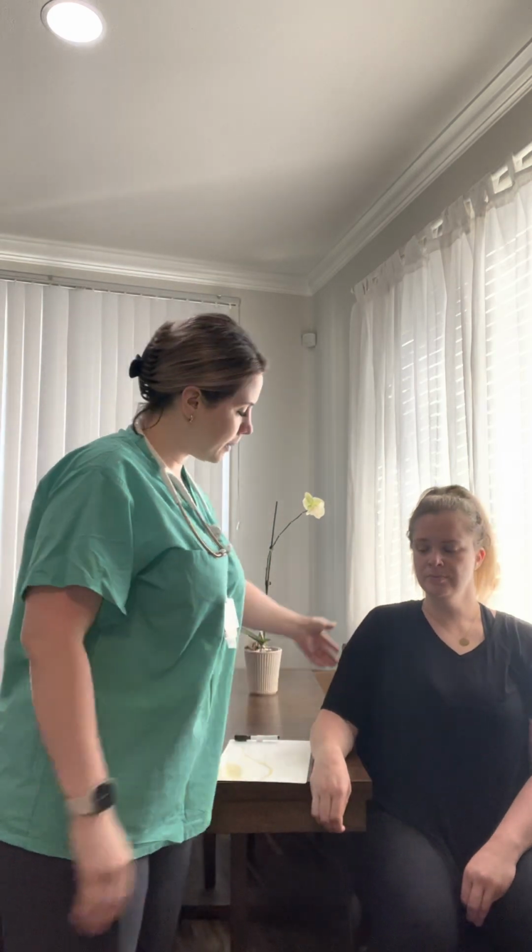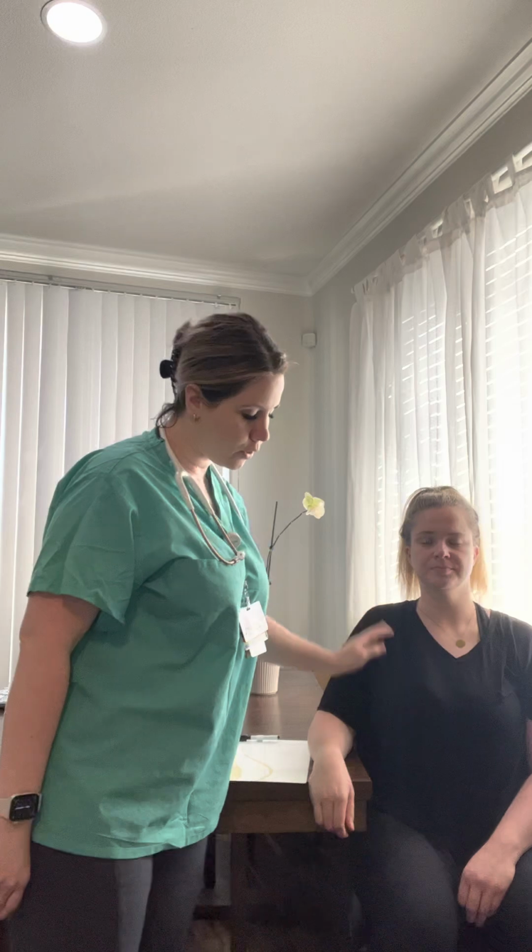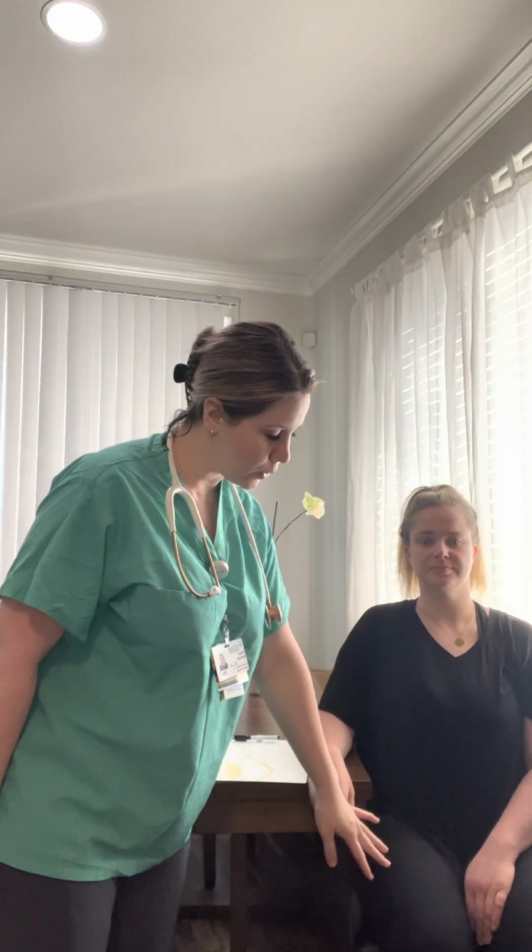Now that we have identified our patient, we're going to go ahead and wash our hands and close the privacy curtain. Now that the privacy curtain is closed and we have privacy with our patient, we're going to go ahead and assess the vitals. So before we begin, we're going to make sure that our patient is sitting up and their legs are not crossed and flat on the floor.